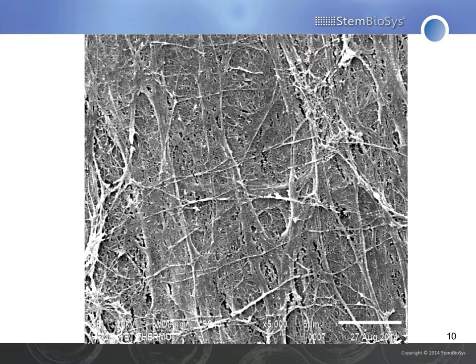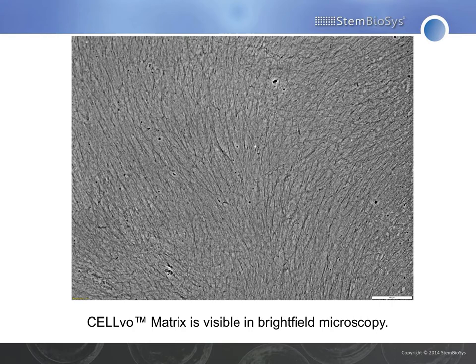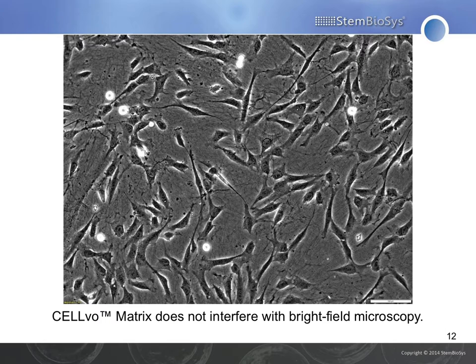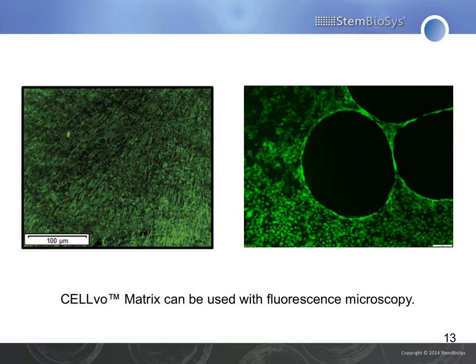A lot of times people have trouble understanding exactly what this product is, so here is a very up-close image of what the matrix looks like at the bottom of the dish. You can actually visualize the matrix in brightfield and see that it has naturally aligned fibrils, and it does not interfere with imaging your cells on the matrix. You can also do fluorescence microscopy — on the left we're staining a matrix component, and on the right we have endothelial cells being stained on the matrix.